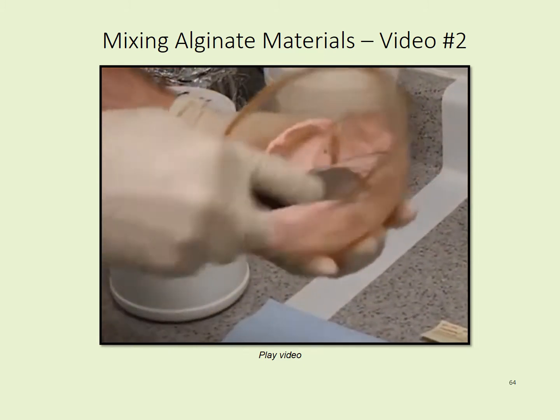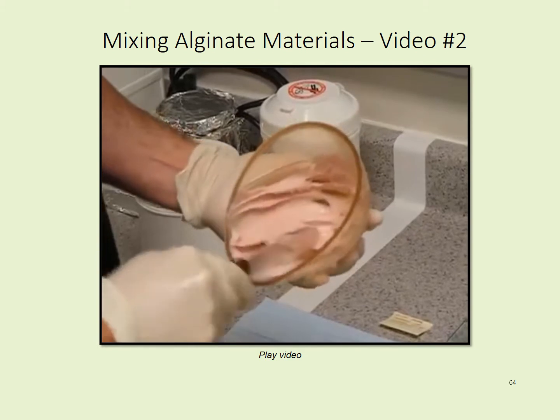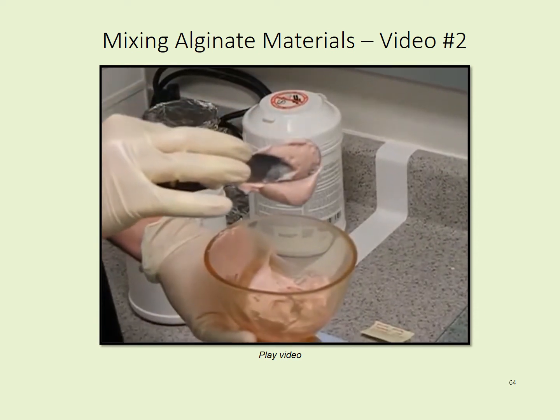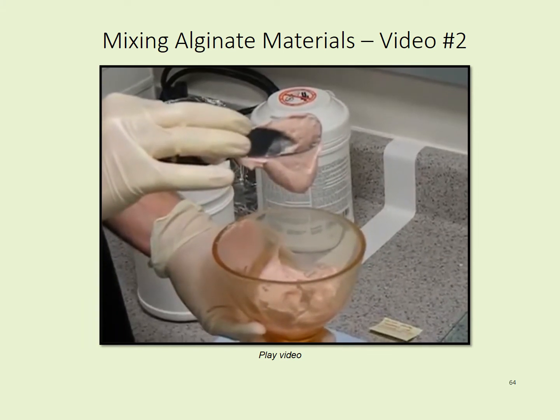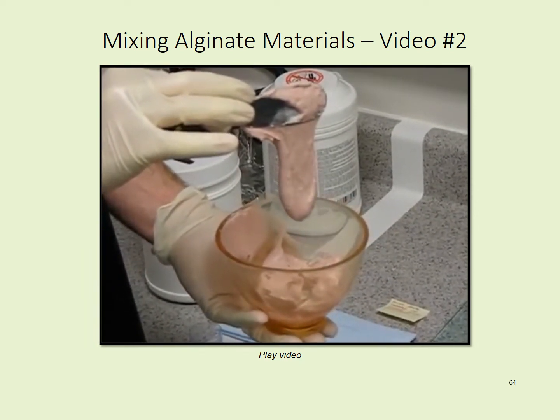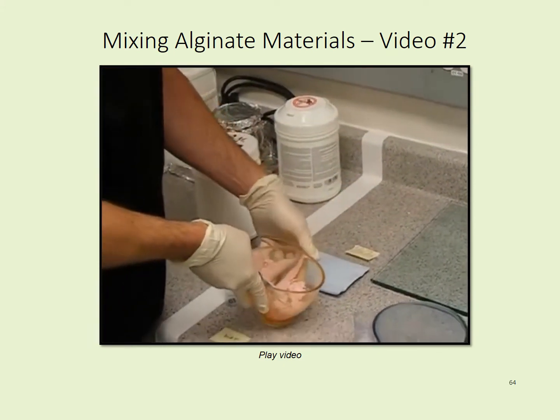What happens is as you mix, you'll notice that the alginate seems like it's the proper consistency, but it starts to droop and drip because it's too runny. And you don't want to place this in your patient's mouth, because if you're doing an upper impression, it will start to fall towards the back of their mouth or the back of their throat and can become very uncomfortable. That is a demonstration of a wet mix on the alginate. Okay, let's move on to the dry.